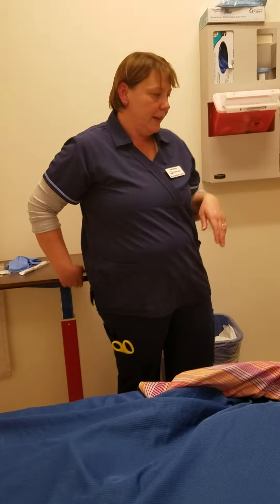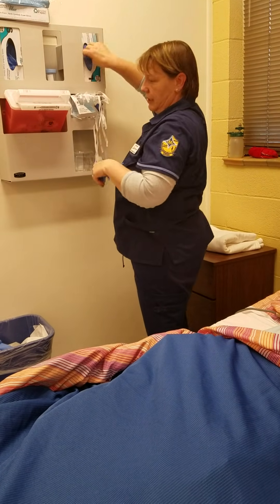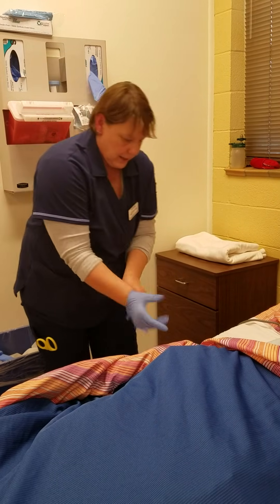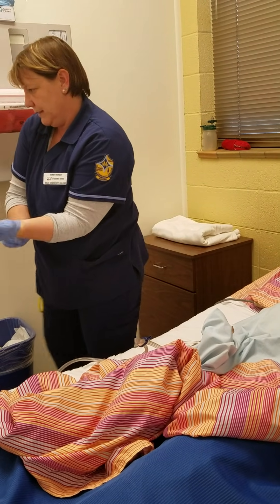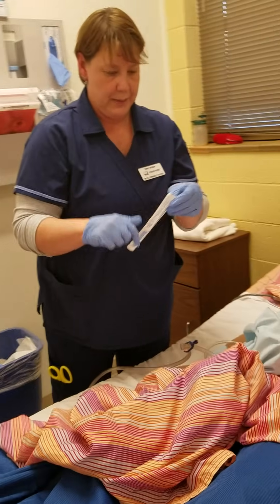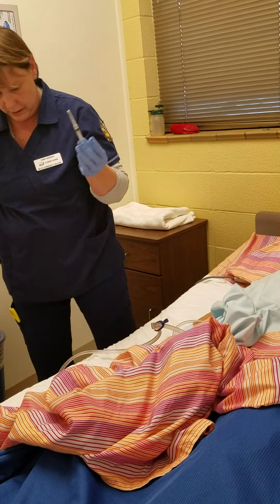I leave the room and now I'm back. Hi Jose, I'm back again — I'm ready to get that sample now. I'm going to go ahead and wash my hands and put on my gloves. It looks like there's some good urine in the tube there. I'm going to get my stuff ready — I have my alcohol swab and my syringe that I need to collect the sample.